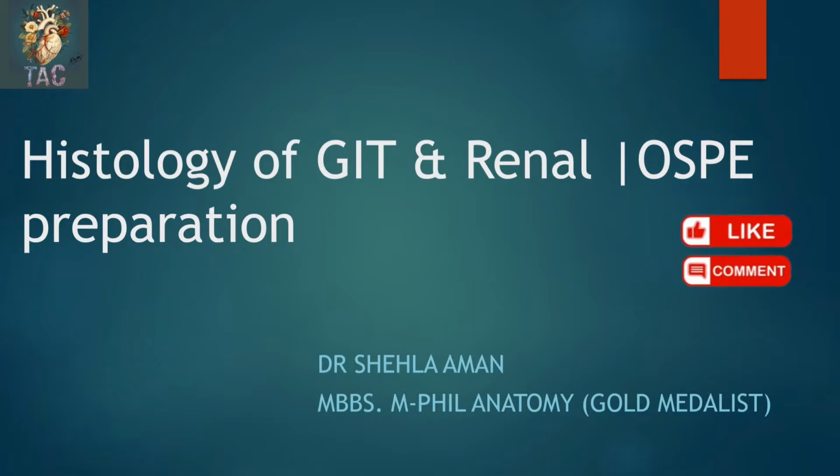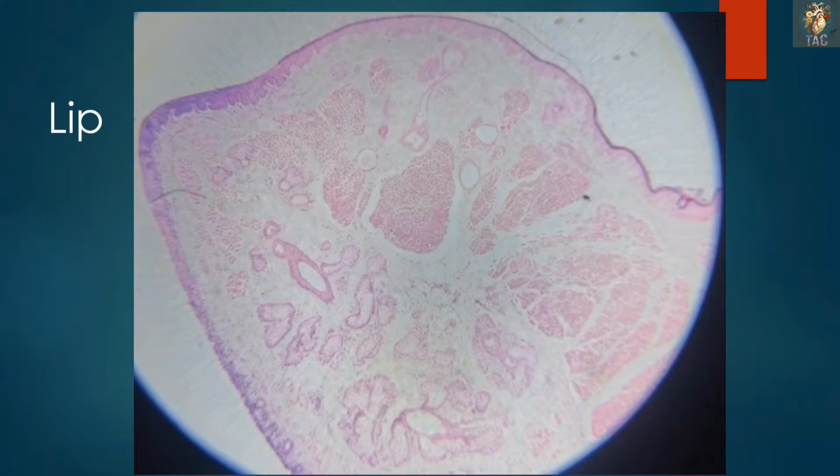In today's class I am going to explain the histological slides of gastrointestinal system and renal system for your exam. So let's start. This is the first slide and the slide is taken that of the lip.